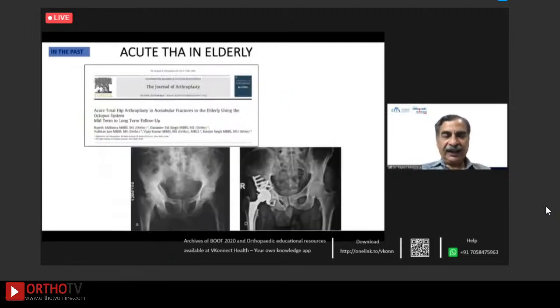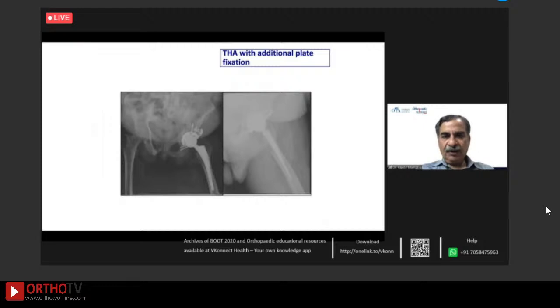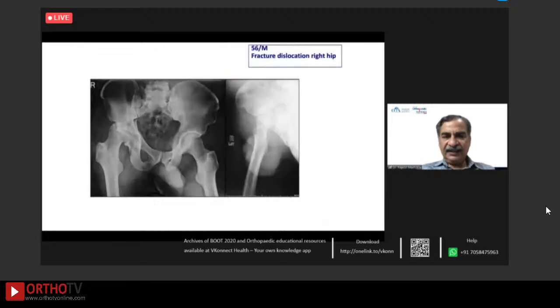And which has led us, particularly because the Indian patients are more morbid with lesser life expectancy, we have published our work frequently. This was the acute total hip arthroplasty in elderly, where we used the octopus cage, which has since been discontinued. But then this will always allow you to sort of restore the bone stock and restore the center of rotation of the hip. With the availability of modern multi-hole porous metal cups, it has become easier, if you like, to fix these fractures and the problems. And very often we would use an additional plate for acute total hip arthroplasty in these cases.